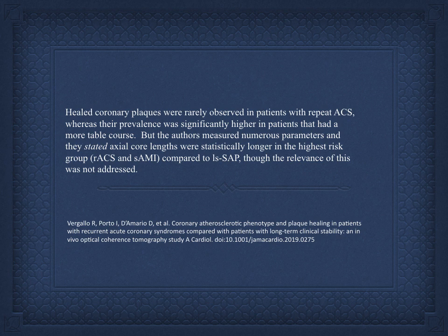Another study that was done in 2019, and we wrote an editorial for it, was looking at the correlation between healed plaques determined by OCT. In a previous paper, I correlated healing with OCT images and long-term stability.